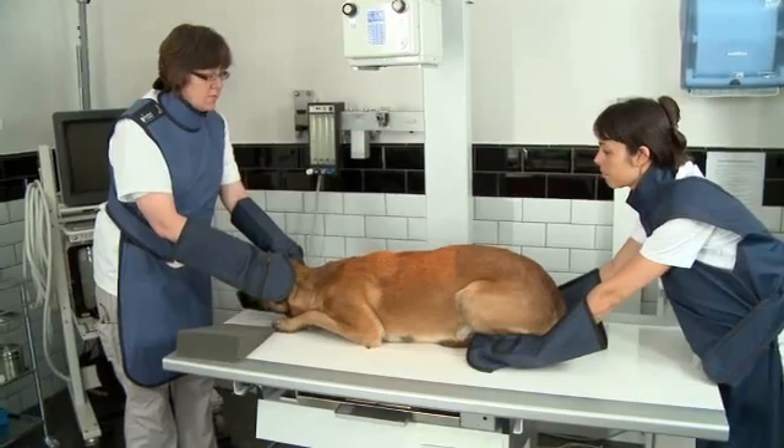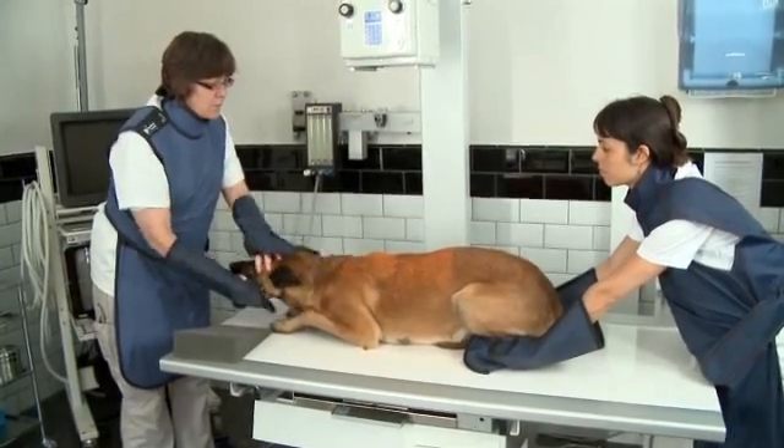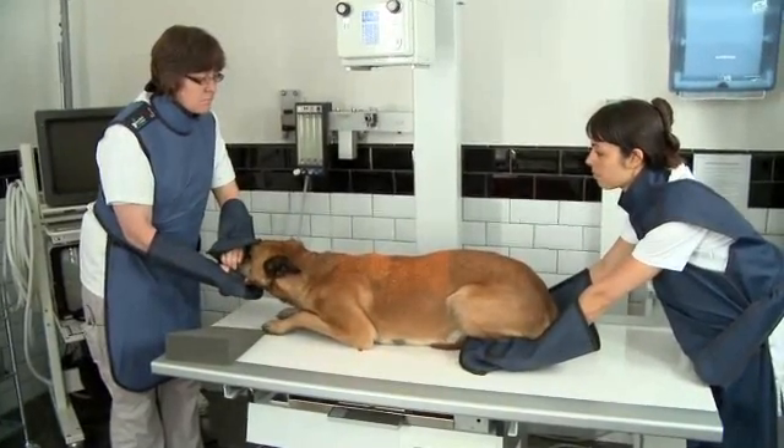Movement artifacts from respiration should be avoided, and this means that in panting dogs the mouth should be closed. Sometimes one has to whistle in the nose of the dog to stop panting or breathing excessively. If the animal is under general anesthesia and intubated, the lungs should be fully inflated at this point in time.